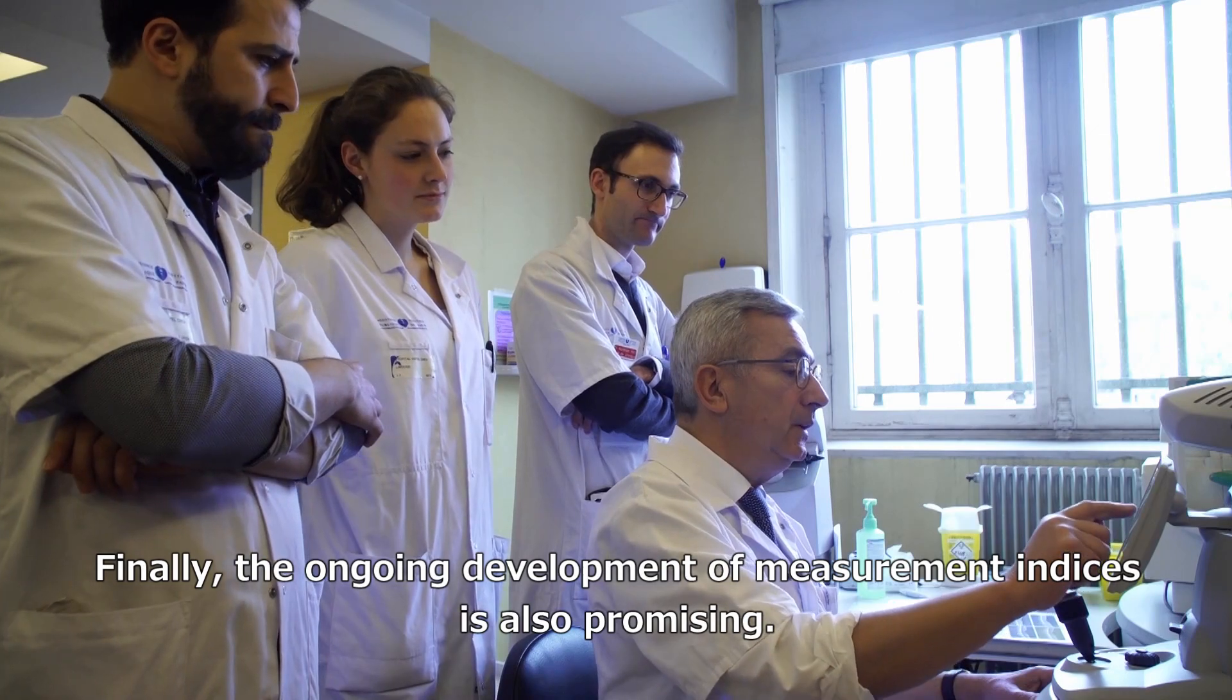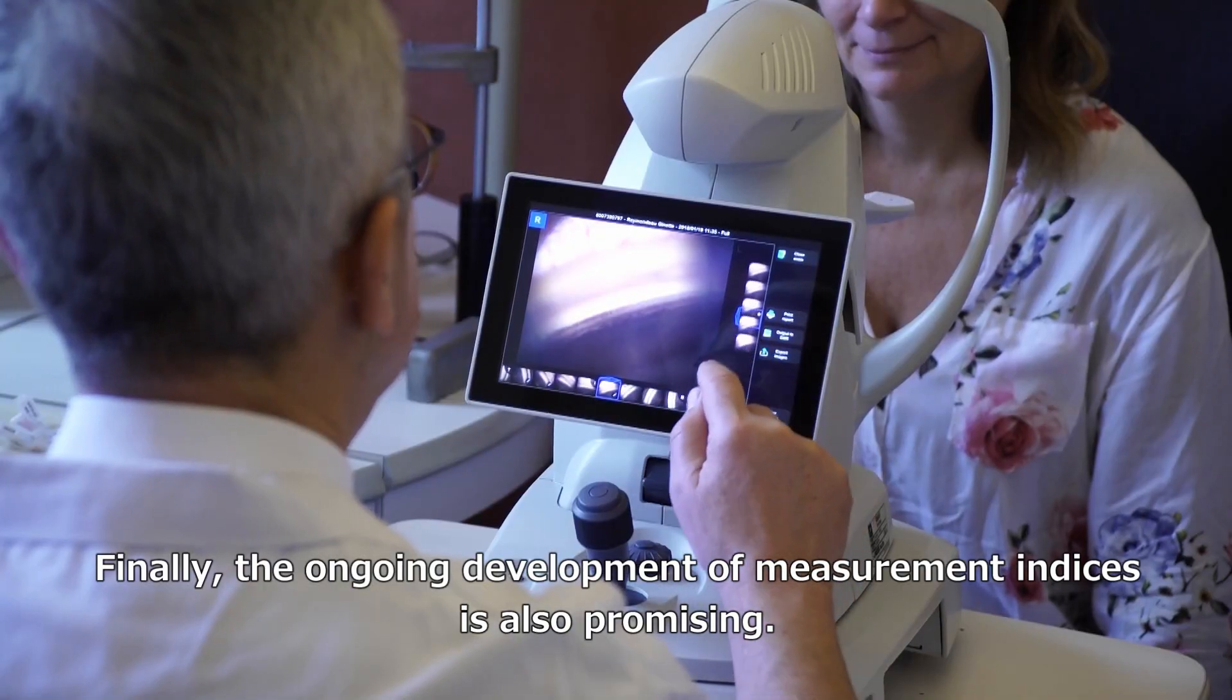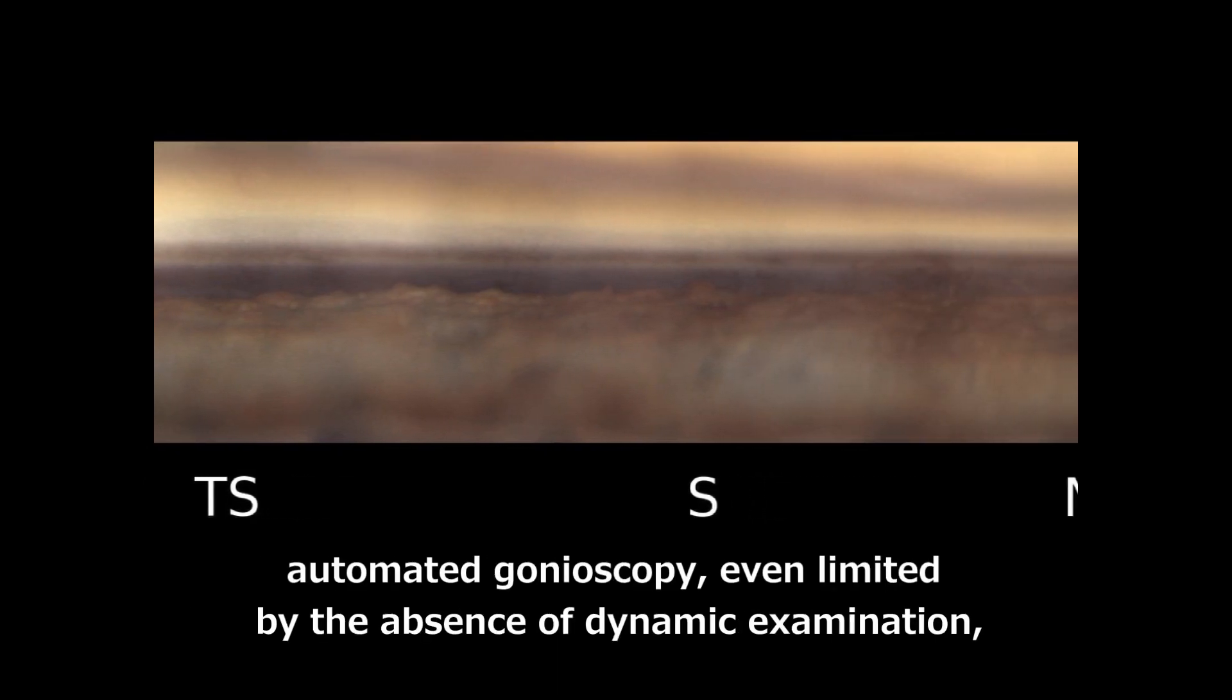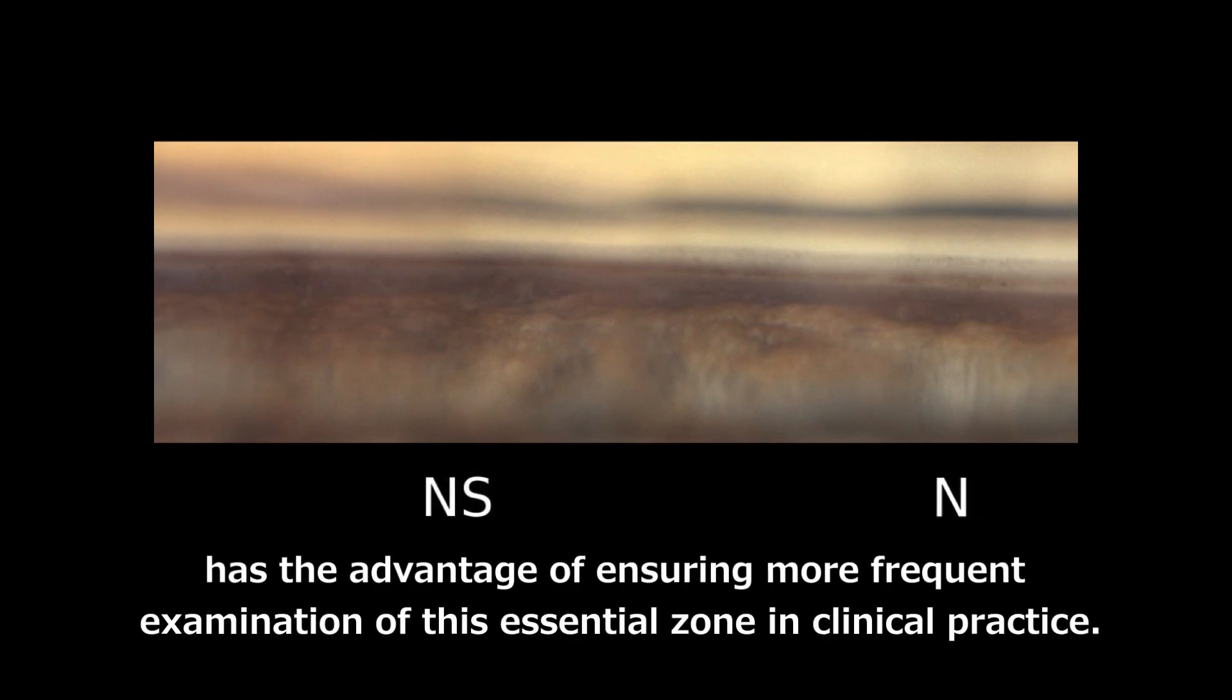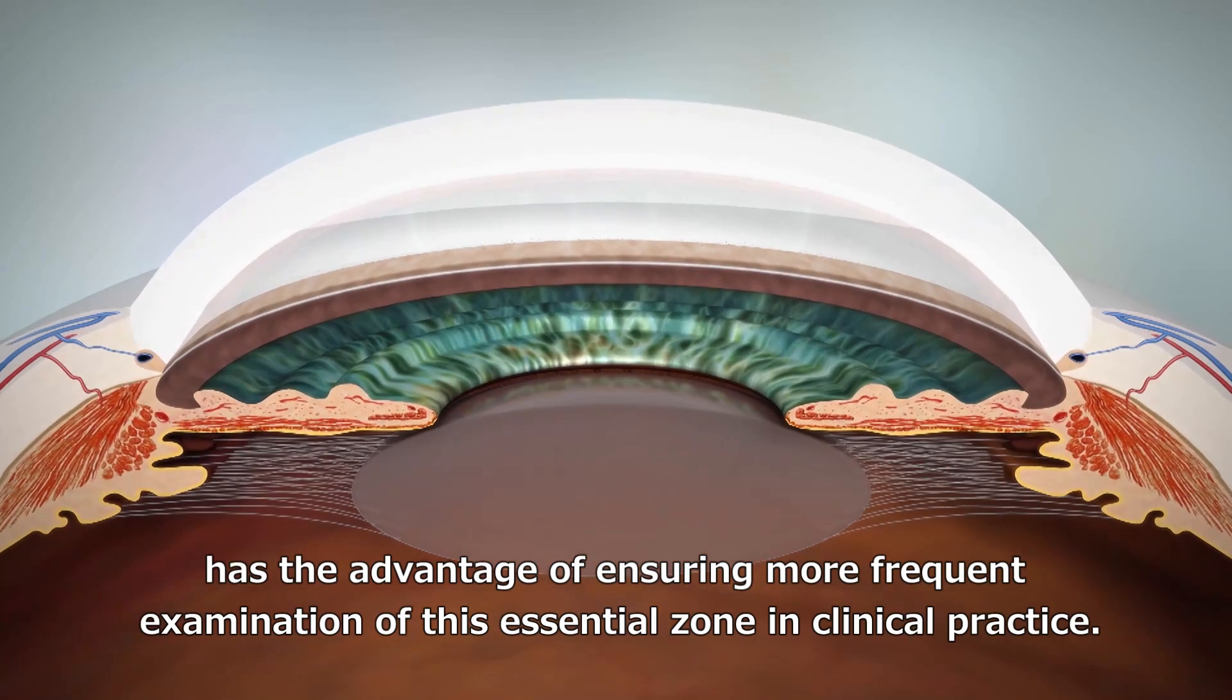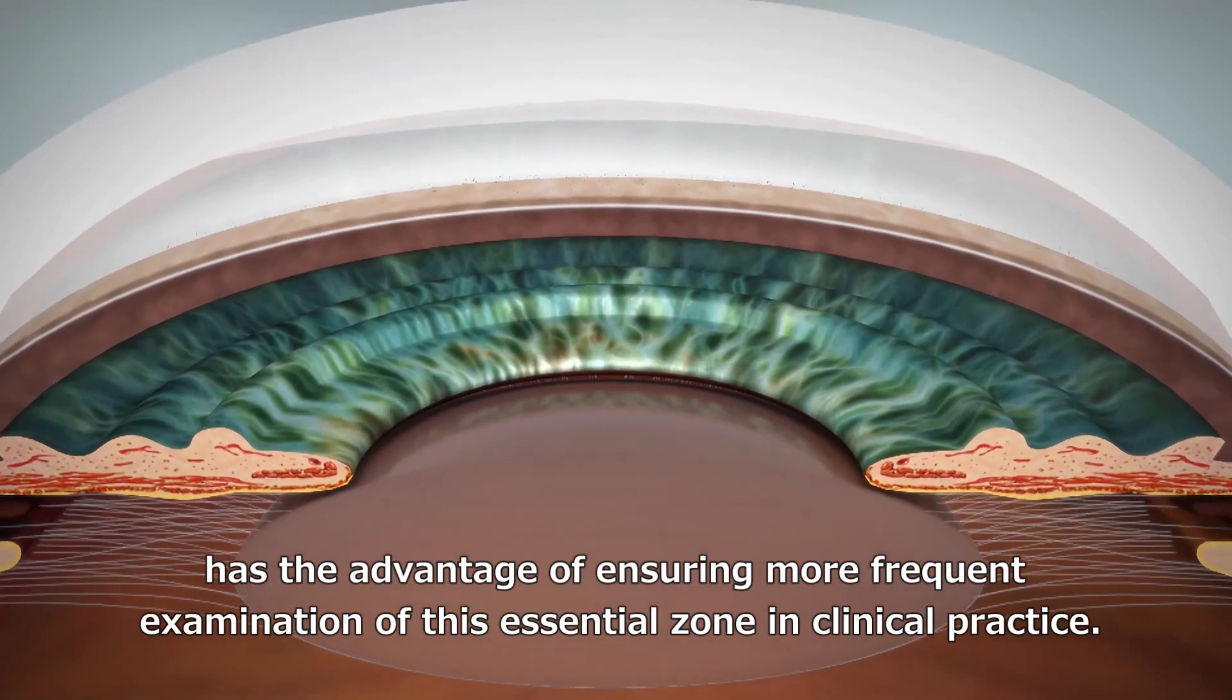Finally, the ongoing development of measurement indices is also promising. By providing rapid visual access to the angle, automated gonioscopy, even limited by the absence of dynamic examination, has the advantage of enabling more frequent examination of this essential zone in clinical practice.